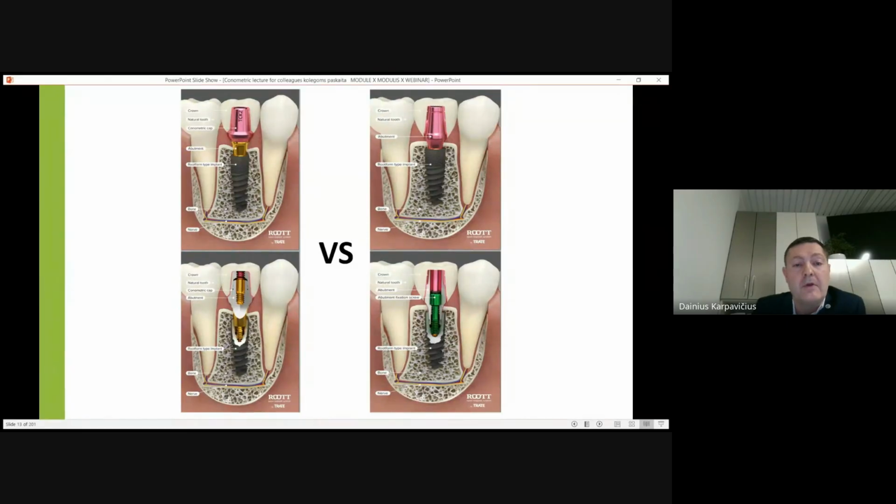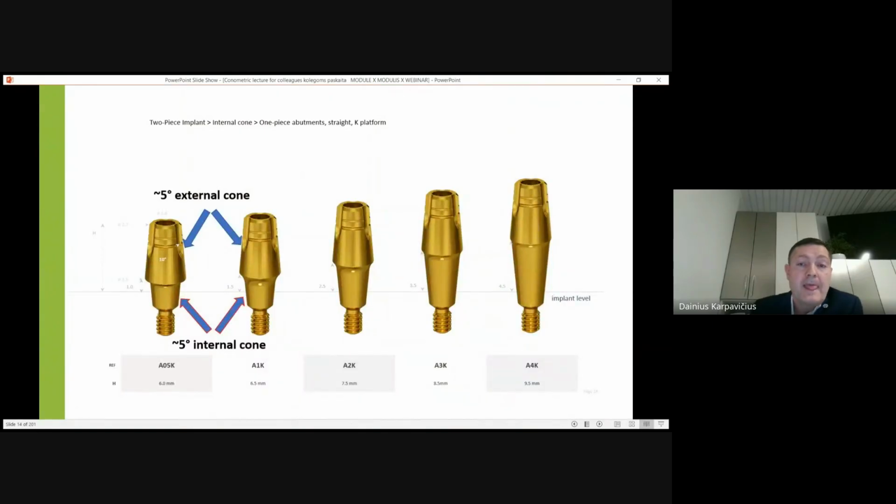And this is a construction that lifts us from the area of the connection in the bone, bone level or subcrestally, where we have the abutments and implants connection, and we are going to the upper floor, to the level of the soft tissues. I mean here where we have more safety and it is more friendly to all the surroundings of our prosthetics.